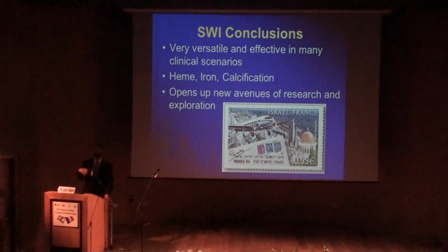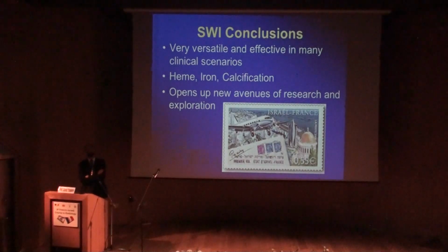So I hope that I've demonstrated for you that the susceptibility-weighted pulse sequence is very versatile and very useful. We're using it in more and more of our pulse sequences, and it's really ripe for research, particularly around quantitative susceptibility mapping, and that's why I'm so bullish on SWI.